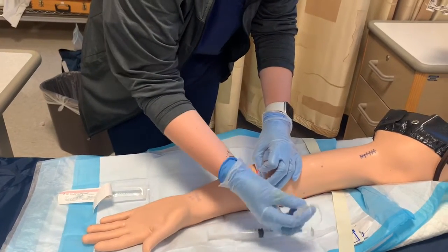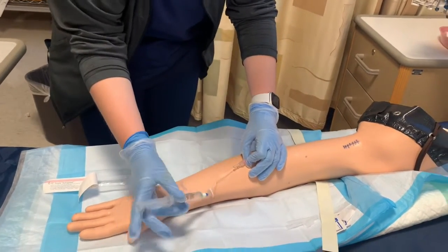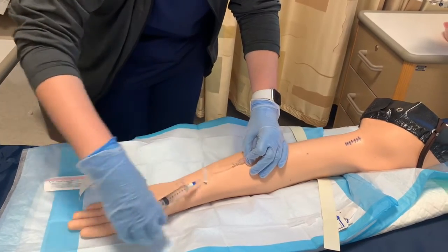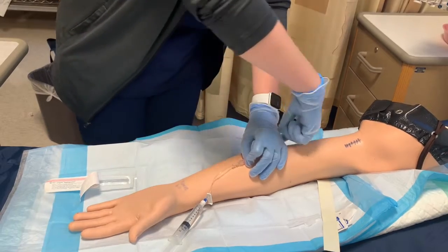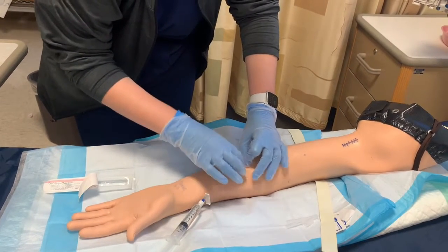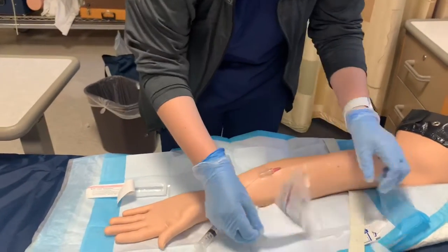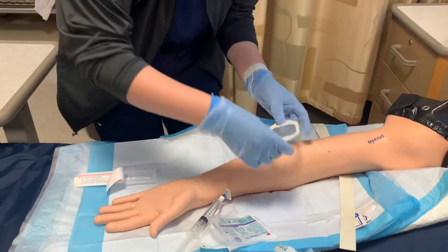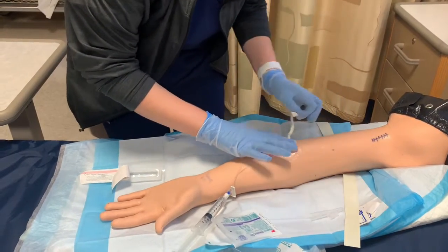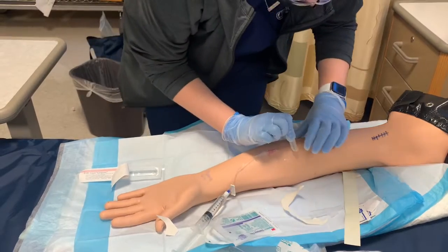So next I'm just going to flush it to make sure it is usable. Okay. And it flushes. So I'm going to add my piece of tape that I prepared earlier. And she didn't complain of any pain with the flushing, so that means we're in a good spot. I don't see any bulging above. So next I'm going to add the clear dressing. And then on this piece, I'm going to record the time and the date that it was placed.